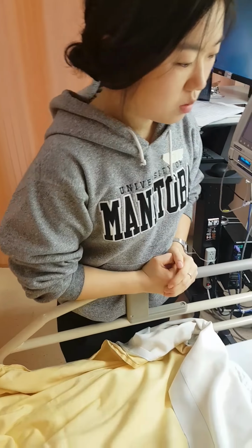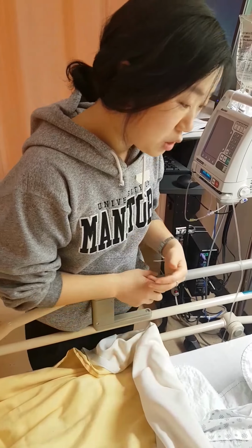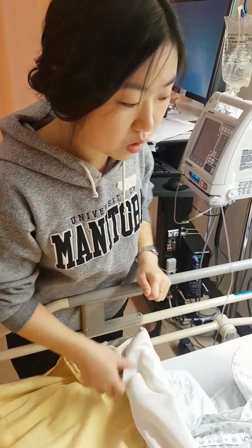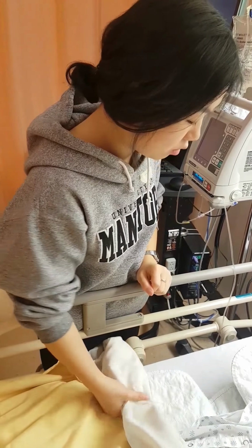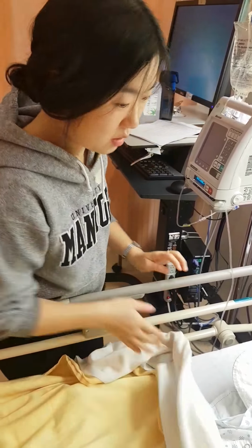Okay, so Mr. Smith, I have your medication running now. If you experience any of the side effects that I mentioned before, or if you have any concerns, I've got this call bell for you here, and I'll come as quick as I can. If not, then I'll come back in 10 minutes to check how you are and to see if the medication is running smoothly. Okay, thank you.